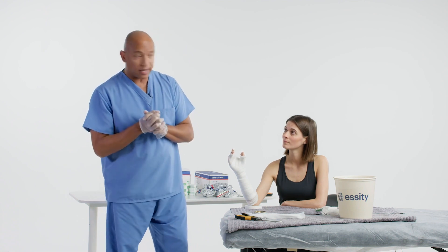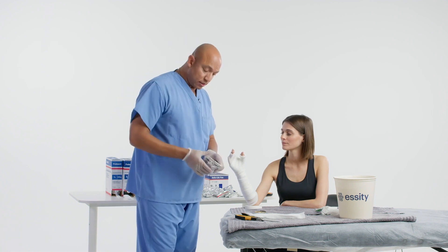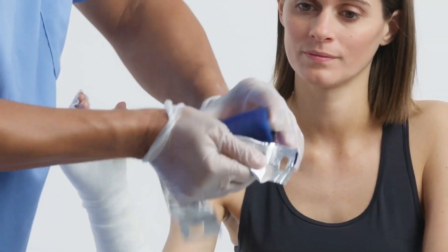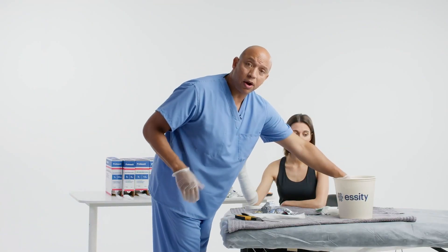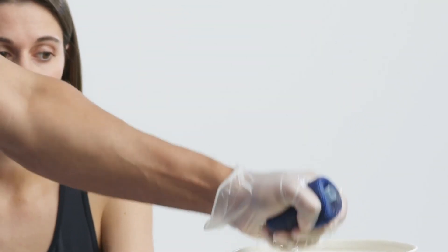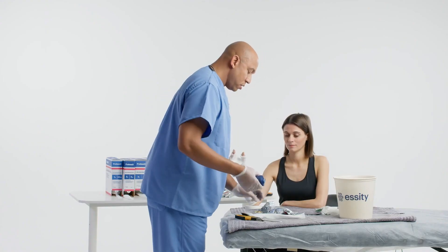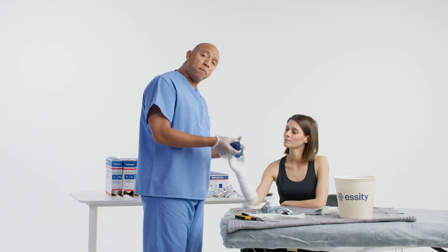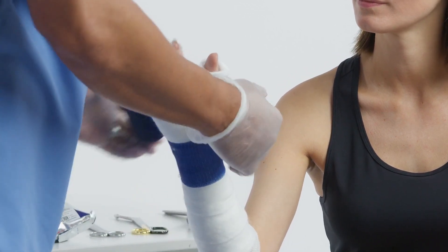The set time is going to be three to five minutes. The cure time is going to be close to 15 to 20 minutes. I'm going to be using DeltaLite Plus. Dip that in the water until bubbles cease, wring it out, and then we're going to start on the wrist and work our way up to the hand and back down to the forearm.